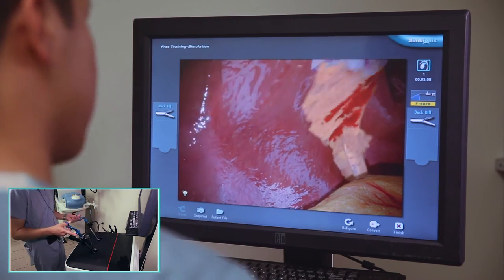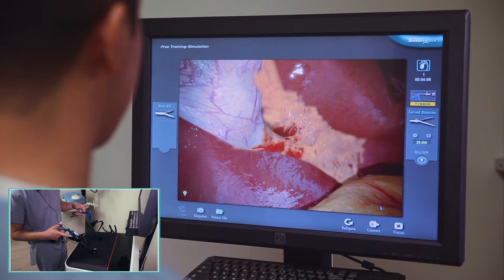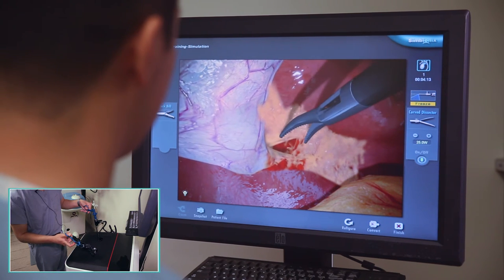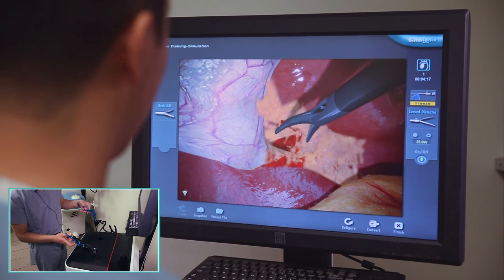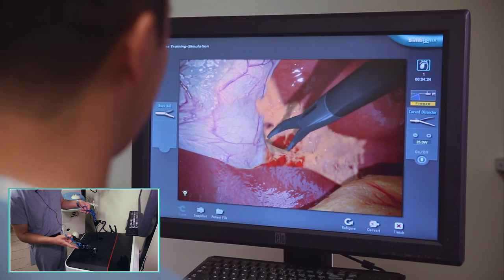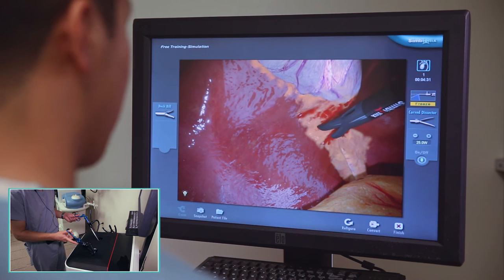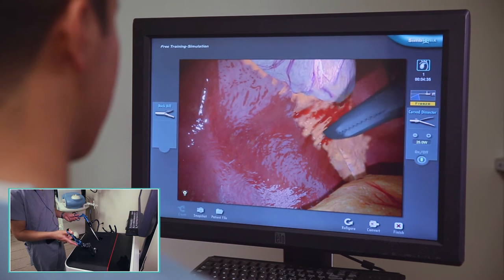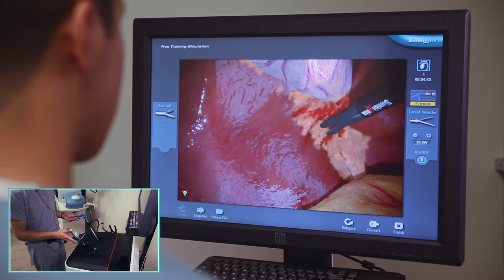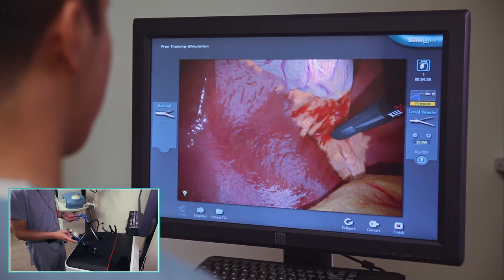Pulling it back, starting to see my anatomy reasonably well. At this point, I feel pretty comfortable switching from the duck bill to a pair of Maryland dissectors in my right hand. I'm still using the duck bill in my left hand for retraction, but now that I know roughly where my cystic duct is, and I can see my artery in there as well, I feel comfortable progressing from the blunt dissector to the Maryland. It's going to be much more effective at taking down adhesions, and the slight curve helps me especially when dissecting down from the posterior aspect of the triangle. But I don't use it when starting out because you'd never know exactly where your cystic artery is, and the last thing you want is a pulsatile arc of blood meaning you've nicked an artery.